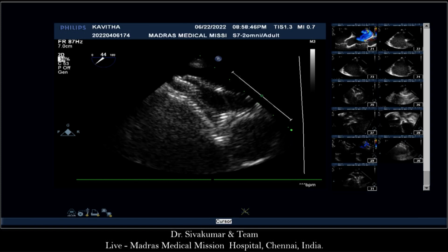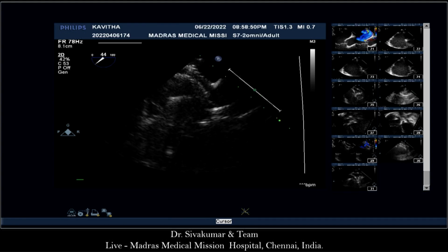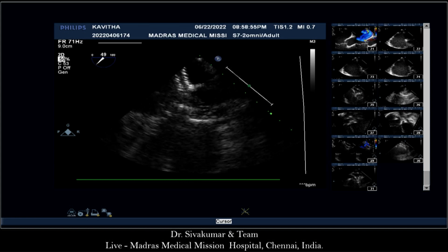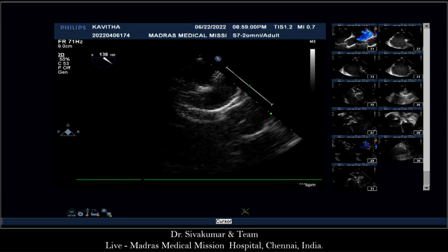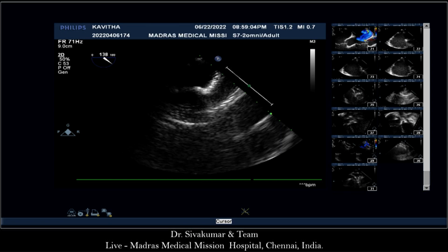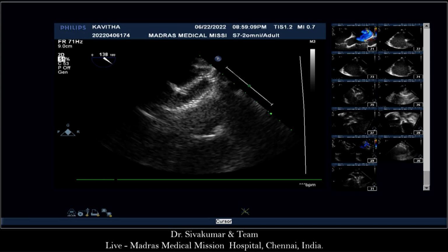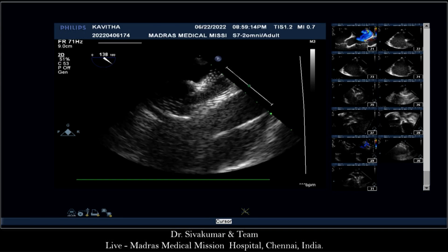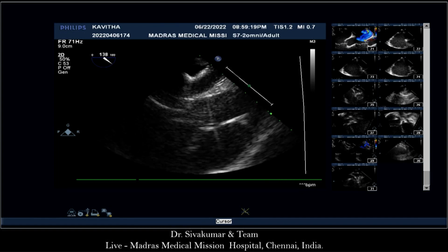So my comment is that it looks very nice, and I guess that the left atrium volume will increase over time, and then the left disc will be better placed in addition to the septum as well as to the mitral valve. My option was 38, but I would use 40 instead because embolization is a bad thing. But I think the left atrial volume will increase over time in any case.